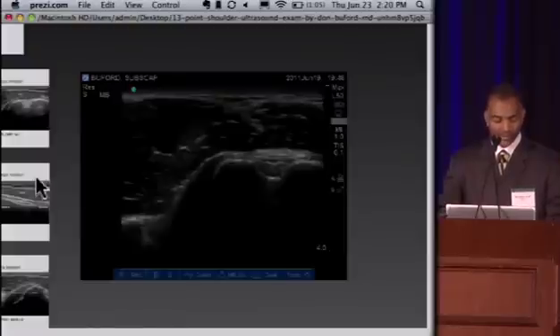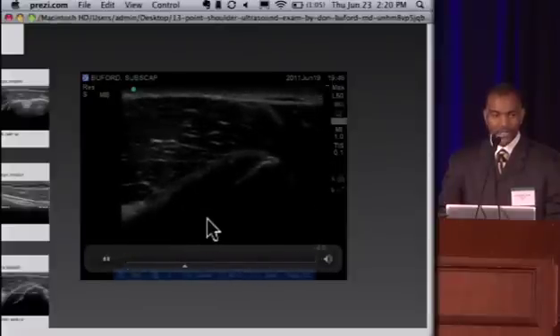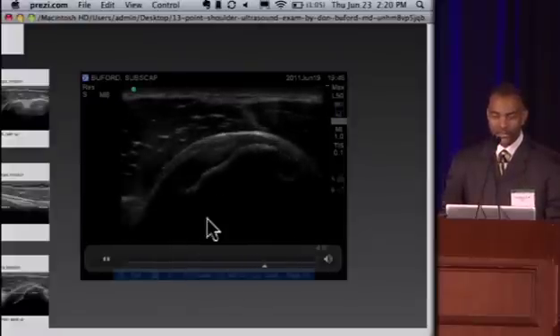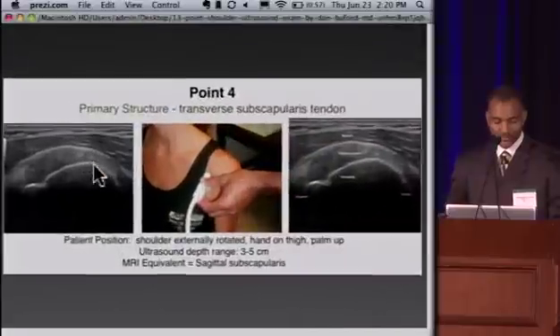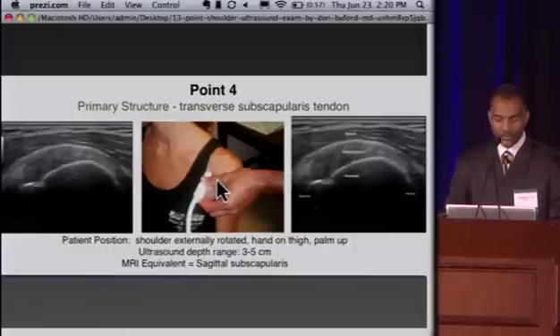Here you can see on a loop one of the unique aspects of this diagnostic modality — it's a dynamic modality. Unlike MRI scanning or even fluoro, you can see soft tissue in dynamic fashion, something I appreciate more the more I use it. Now that we've seen the subscap at point three on its longitudinal axis, at point four we look at the subscap on its transverse axis. We rotate the transducer 90 degrees, positioned a bit more medial compared to the long head of the biceps because the subscap inserts medially.